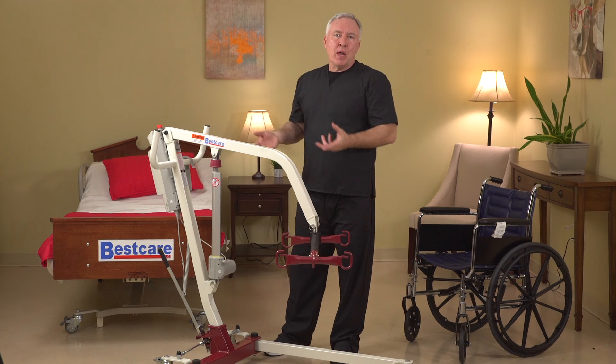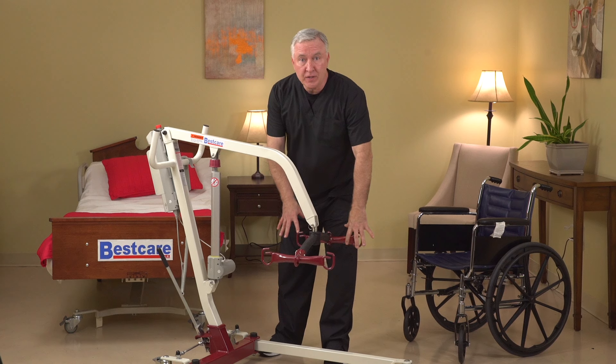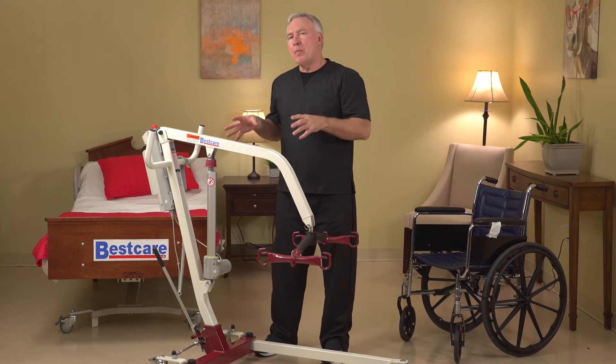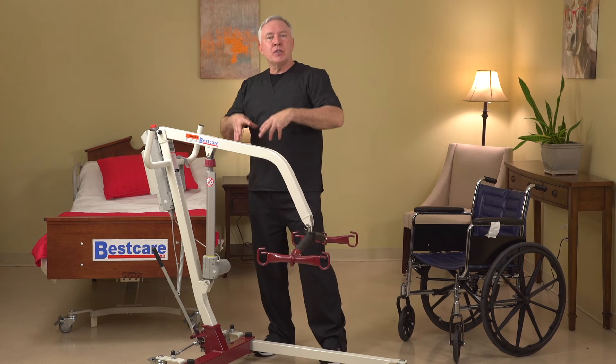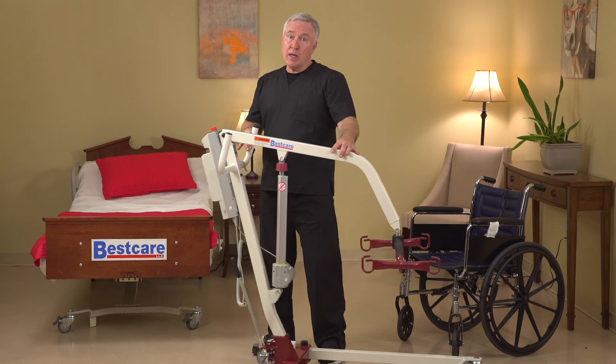Now what I mean by brand new — the colors red and white are different. We've changed our spreader bar to a fixed six-point spreader bar, but this product resembles our PL500HE, which was in our line for a number of years before these new products were introduced. So you're going to see a lot of similarities between the PL500HE and the PL228 and 182.